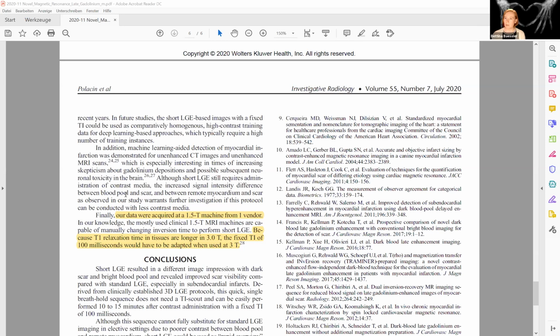Okay. And the last one: what about 2D single breath hold, single shot PSIR imaging instead of 3D single breath hold, to be insensitive to TI and fast? Have you tried to compare these two strategies on the same patient? I didn't actually. And also, the one vendor with PSIR in our hospital, I know it's generally possible, but in this case it was not possible to change the inversion time below 150 or 160 milliseconds. So I tried, but I just dropped it because I couldn't make it. I know that it's technically possible, but I wasn't looking deeper into it because with 3D LGE imaging we are more flexible. So I tried to answer that question, but I'm still stuck in it.